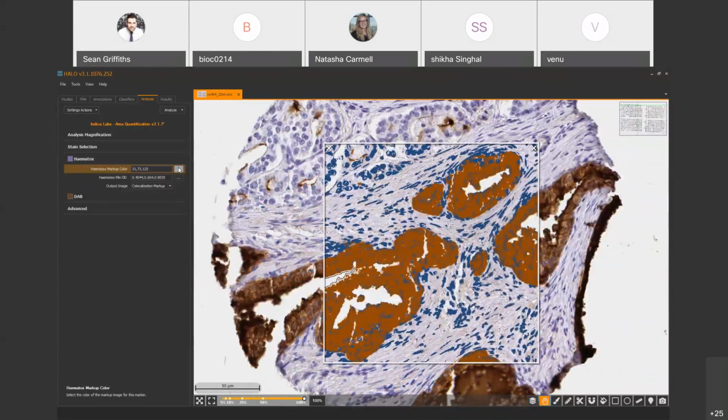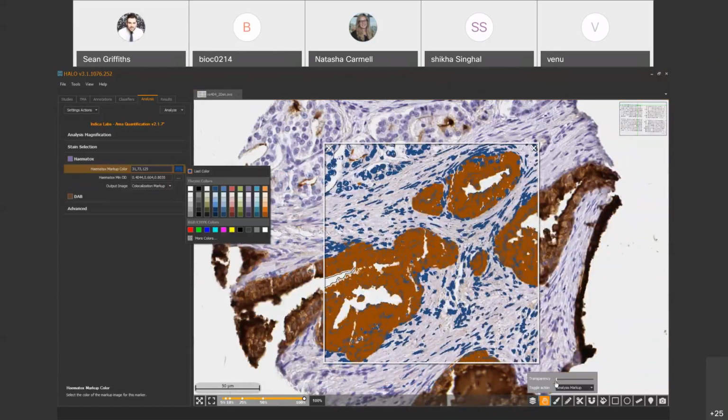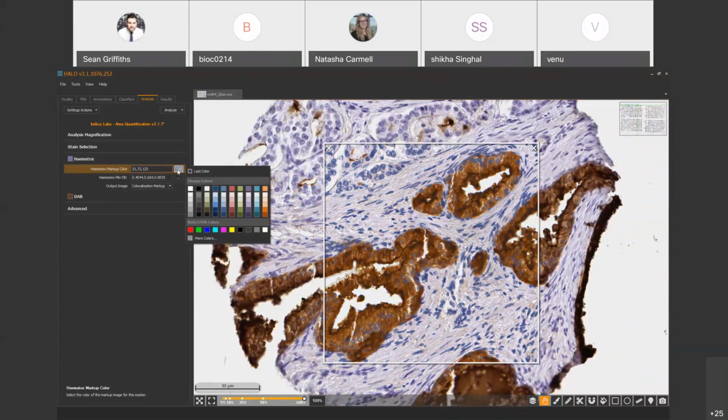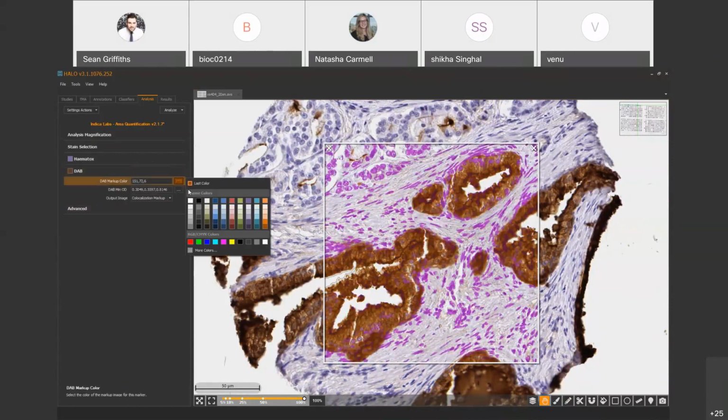totally different color, so that when you view the transparency down here, you get a clear indication, you're not having two overlapping colors. So some people like to go for totally different. So have the nuclei in pink and this in cyan.